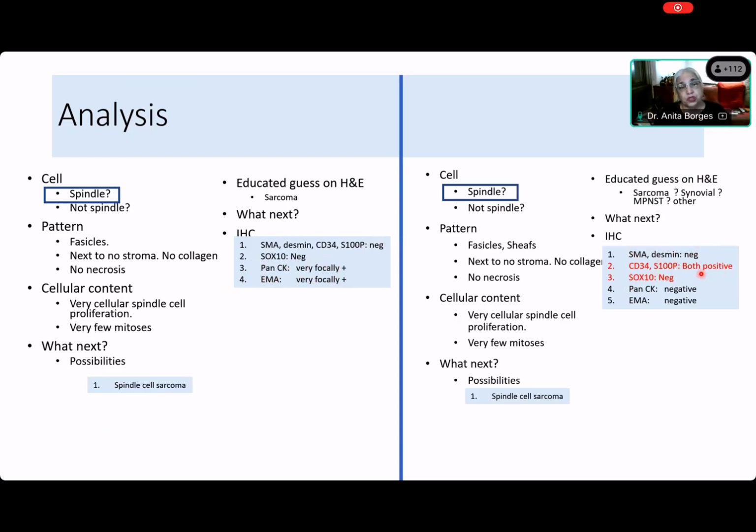Now, why did we do cytokeratin and EMA? Come on, you know this. To rule out carcinoma. Do you think that you know the history? What's the history? You think you're going to get a carcinoma? No. So not to rule out a carcinoma. We think that these are spindle cell sarcomas, but yet we did cytokeratin and EMA.